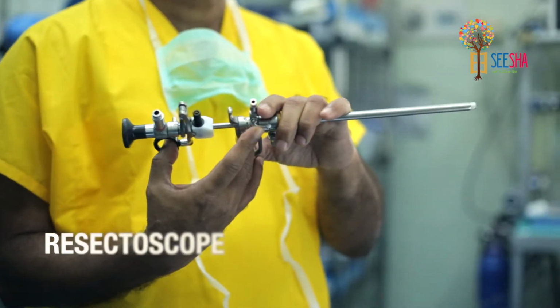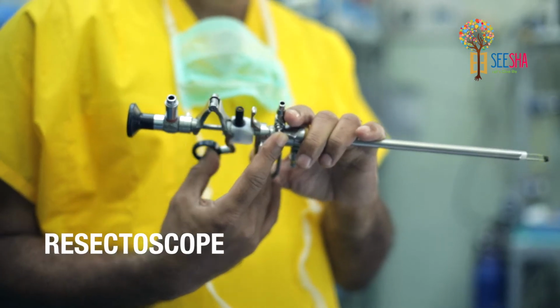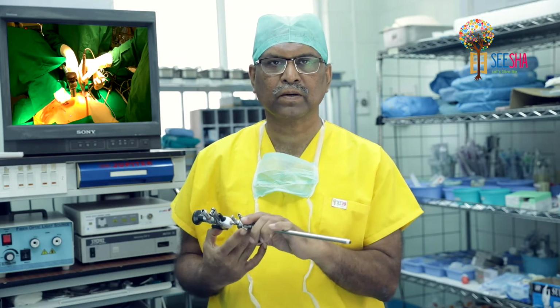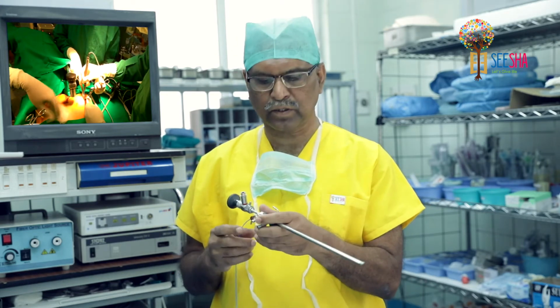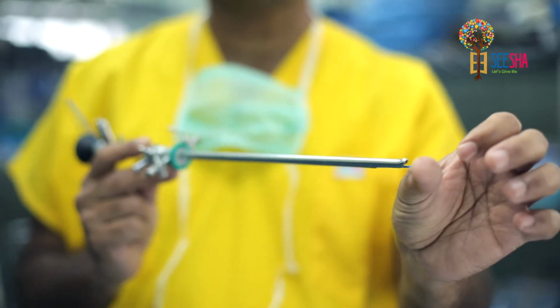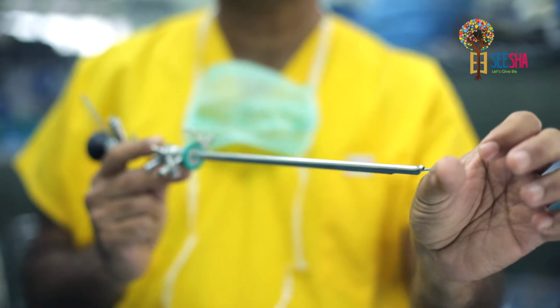We can use the resectoscope to resect the septum in the Asherman syndrome, or small fibroids which may be present inside the uterus, which is a cause of infertility. If it is difficult to pass a resectoscope, even the ordinary cystoscope along with the Bugbee electrode could be used for vaporizing or cauterizing these small defects.